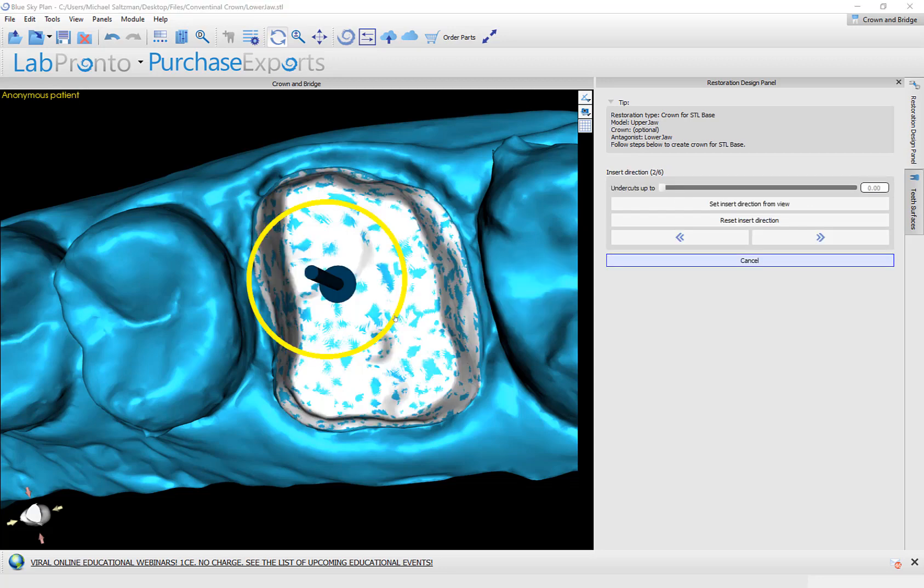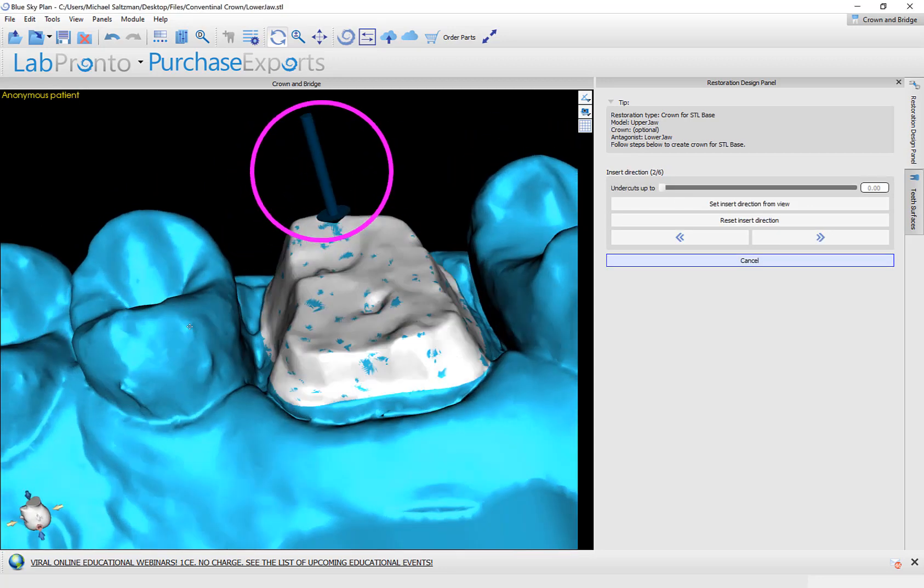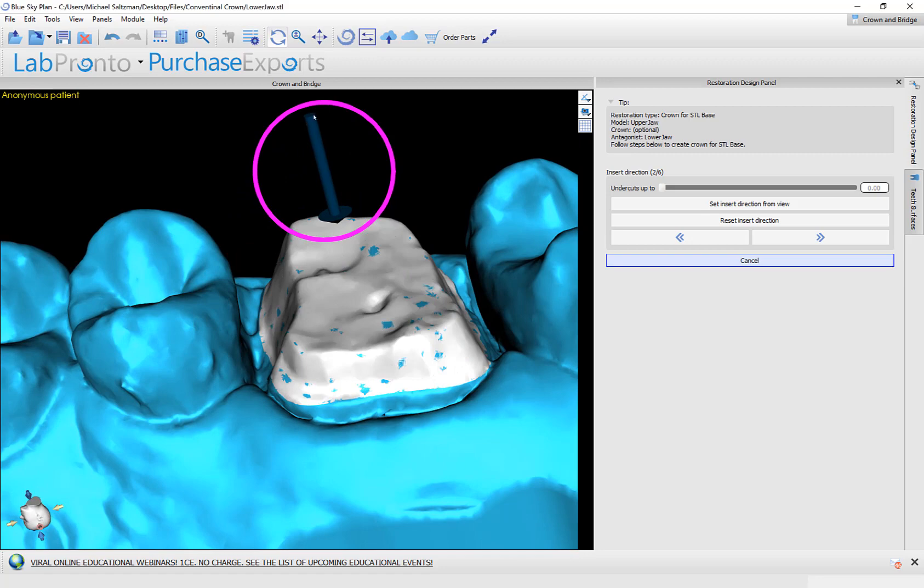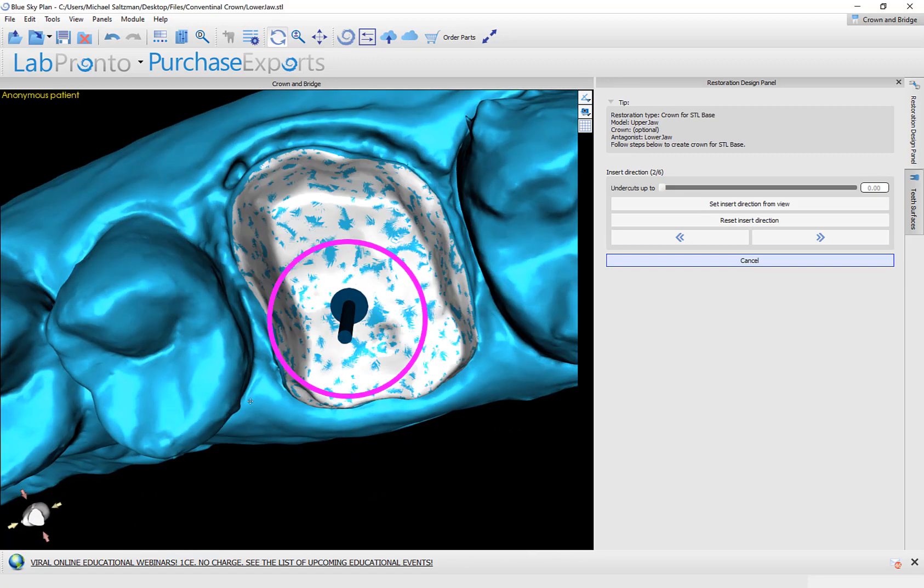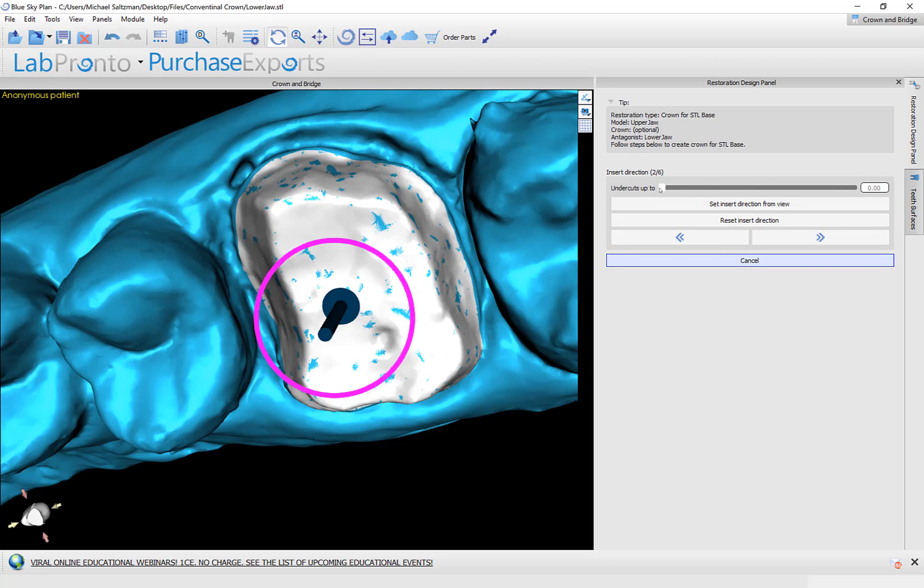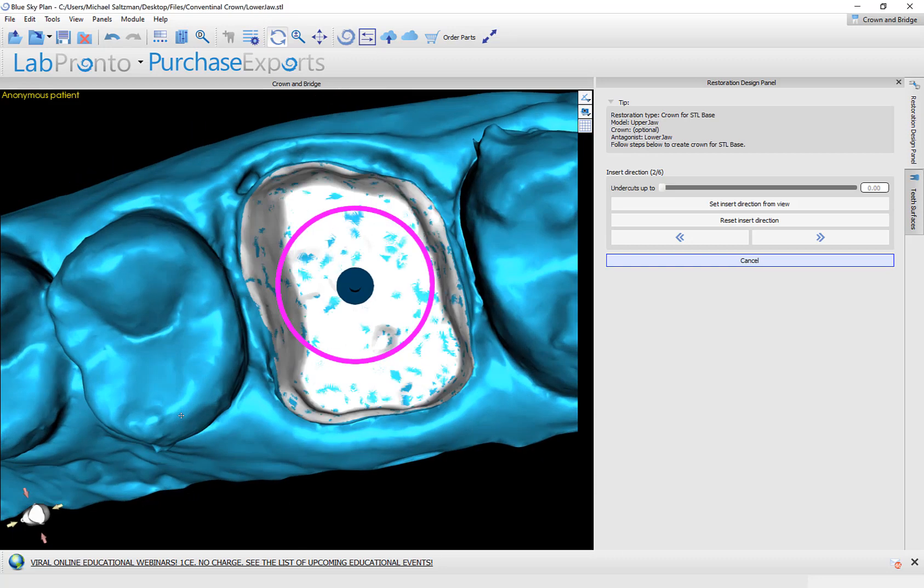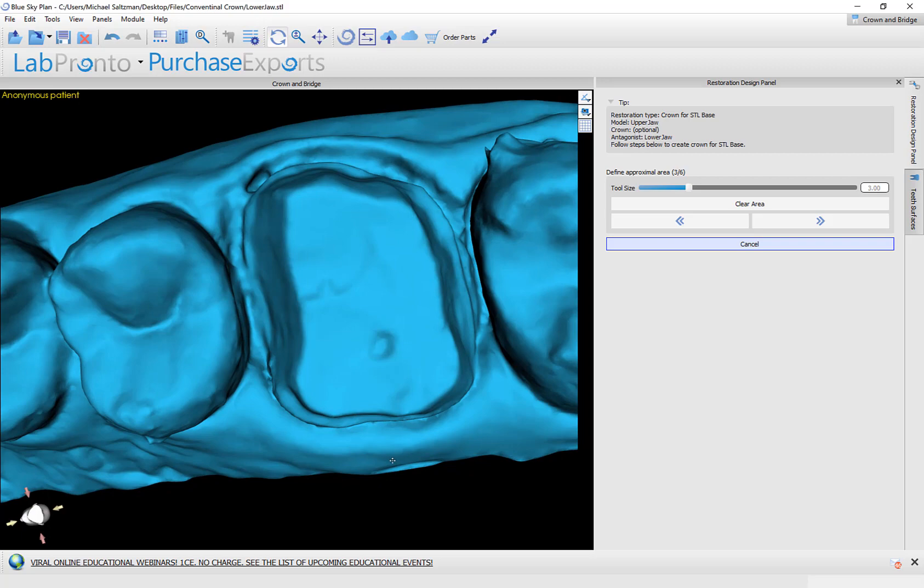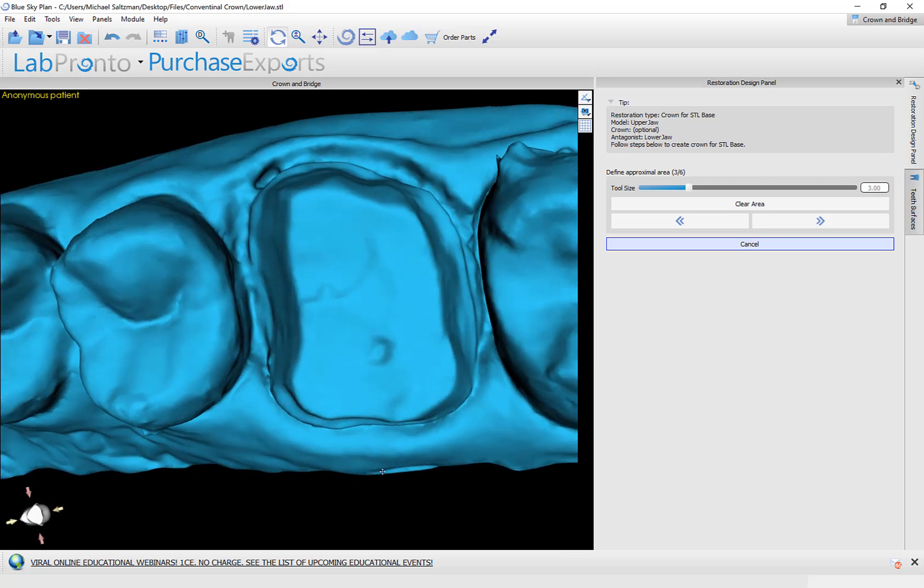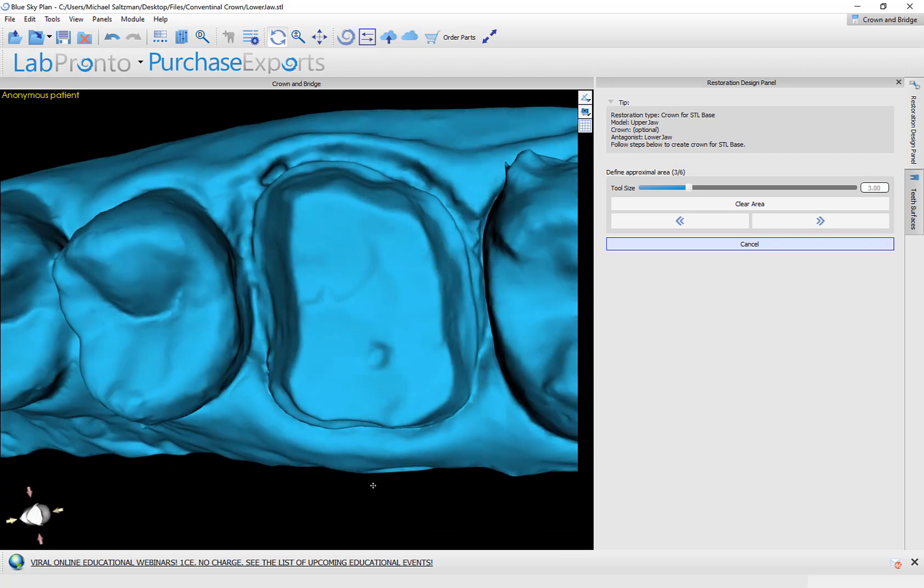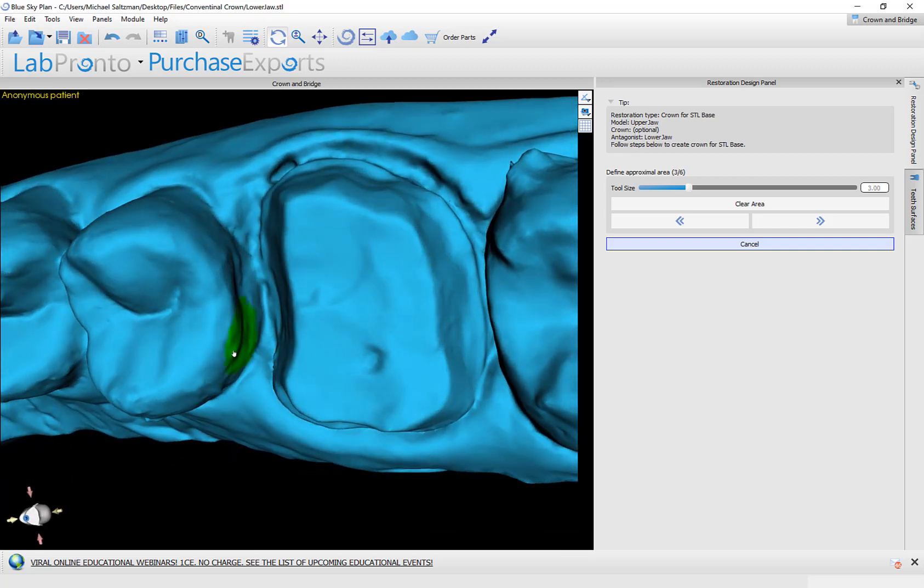And we are defining the insertion direction. We could do so by using the widget and modifying the direction of the arrow, or we could position the view on the screen and then click set insertion direction from view. We are able to tolerate undercuts if you would like to do so just by using the slider and grabbing and dragging that. At this point, I'm going to click next and move on to step three of the process where I'm going to mark the proximal areas.